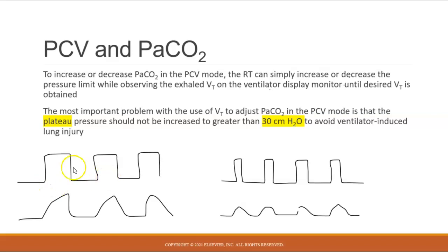Just again, to remember that I-time is also going to affect the volume delivered. These two graphics, my crappy drawings, are supposed to show that I'm using the same pressure control here and here. Let's say it's 25. So this is a pressure control of 25. This is a pressure control of 25.